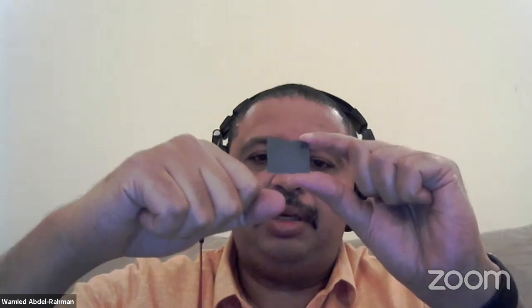Now for the patient, that's that piece of film. For this small piece of film, we wrap it with a piece of paper, and we use some tape. And outside, for example, this goes to position 7, position 8.